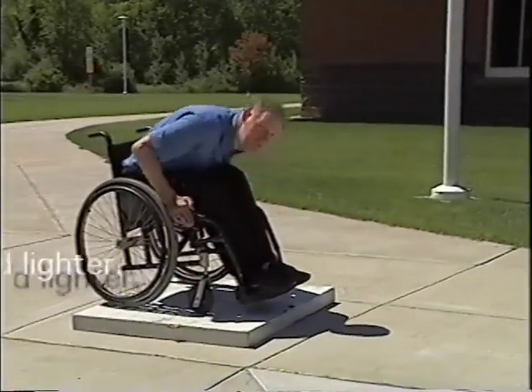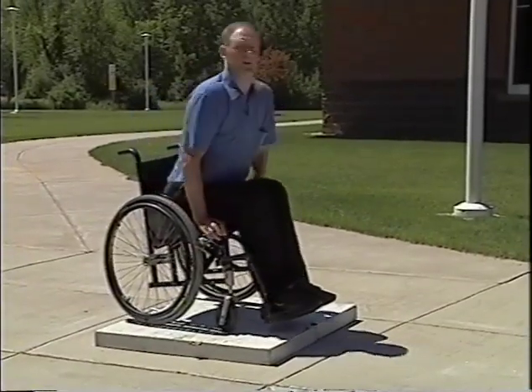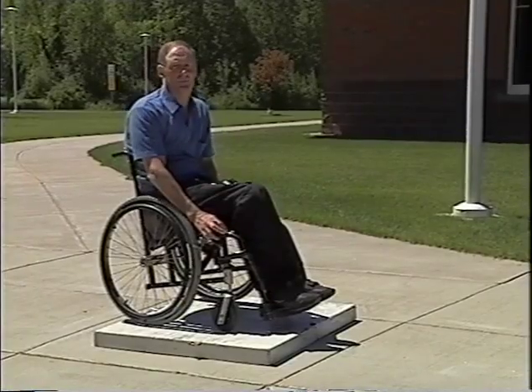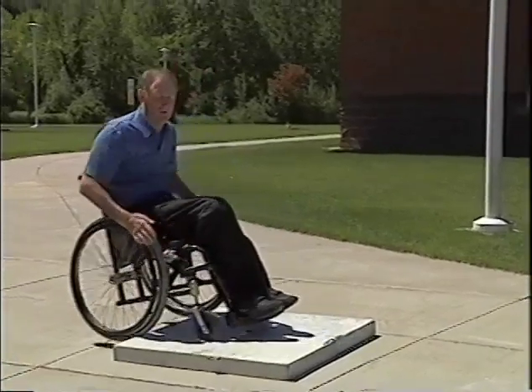And now you're on top of the curb. You can put your brakes on. You have to readjust your body. Not a problem. And that's a typical way of getting up and down curbs for a quadriplegic. And the same backing off.